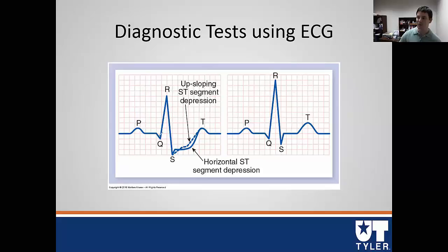In an ECG, what we have is this baseline is no longer consistent. So what we call this is essentially ST segment depression. Again, you should just note, oh, something doesn't look right. We can say what doesn't look right is this segment of the diagram. This is one of the most important ones because, like I said, this is what exercise physiologists would see.